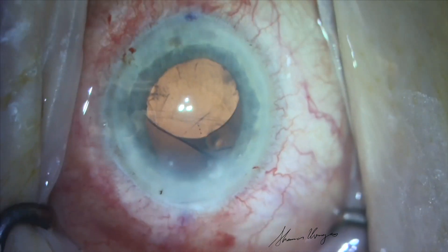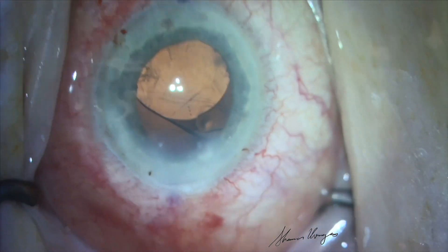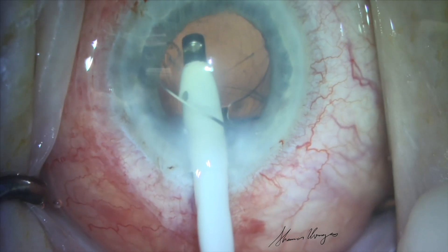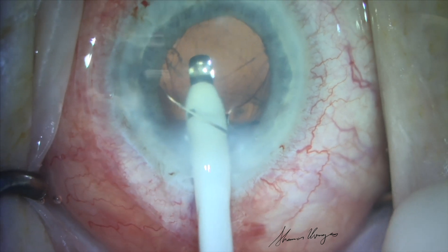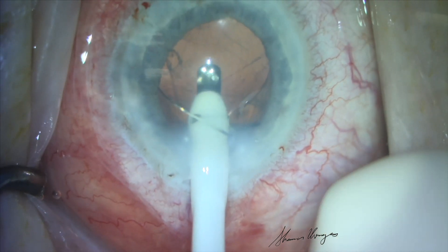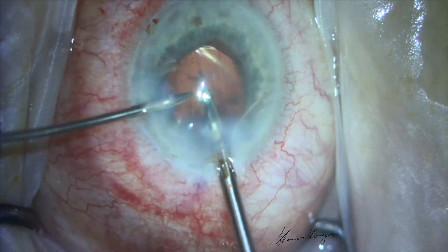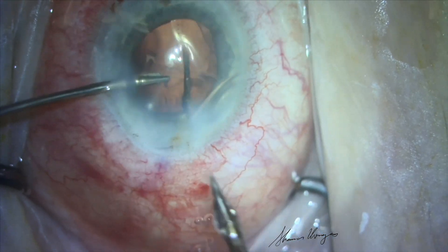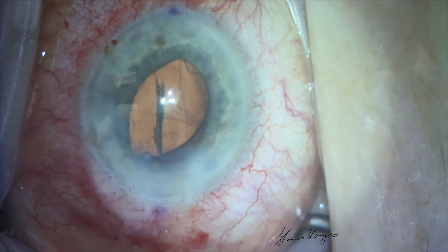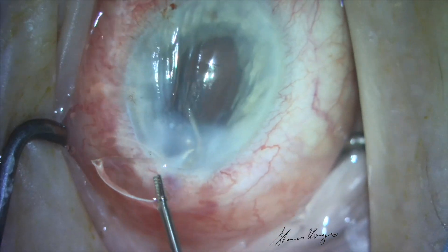We determine that the panoptics will not be stable in this patient's eye long term and that there is an open posterior capsule that will not support a single-piece acrylic lens. We then perform an anterior vitrectomy in preparation for explantation of the panoptics. 23-gauge MST micro-holding forceps and an IOL cutter are introduced to bisect the implant. The inferior haptic is removed, then the lens is rotated out of the primary incision in a cartwheel maneuver.